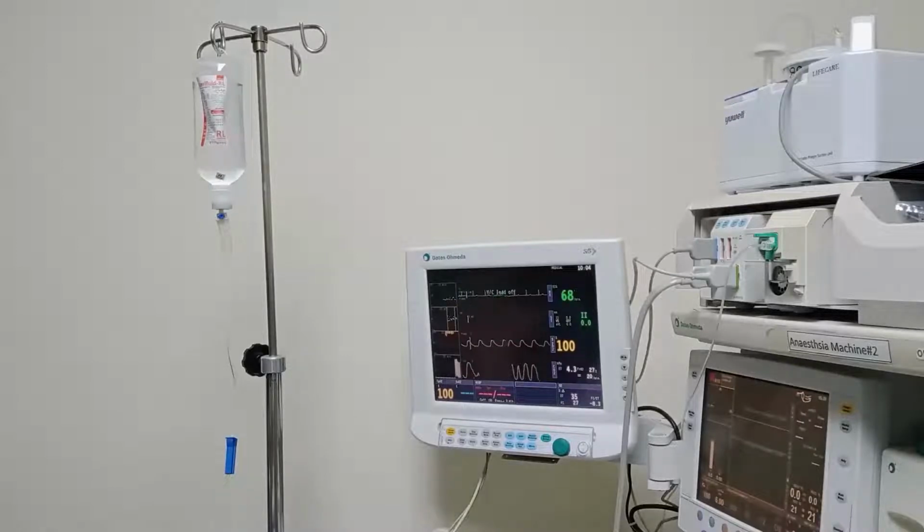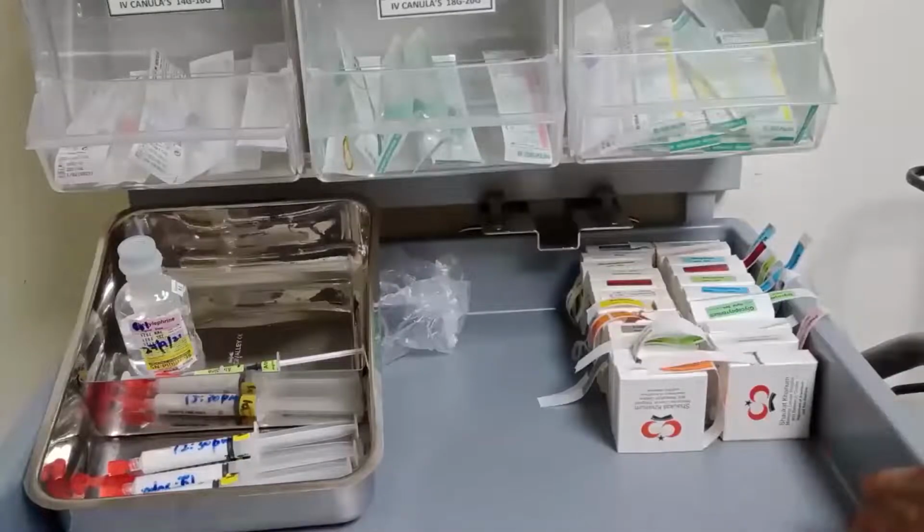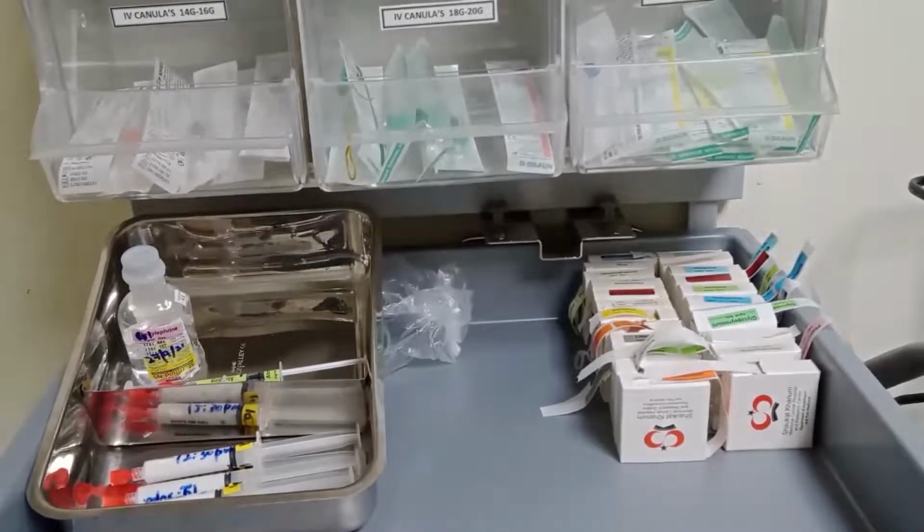Welcome to Interventional Pain Management. Today we are going to do the caudal neuroplasty procedure for our patient. For this purpose, we need standard monitoring, standard secured IV access with running IV fluid, and emergency medicine for backup, along with the medication in case the patient requires sedation.